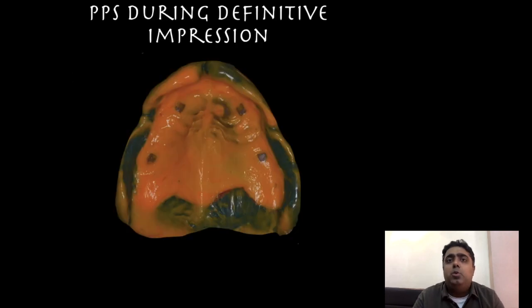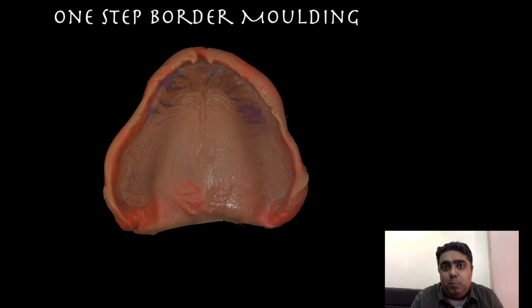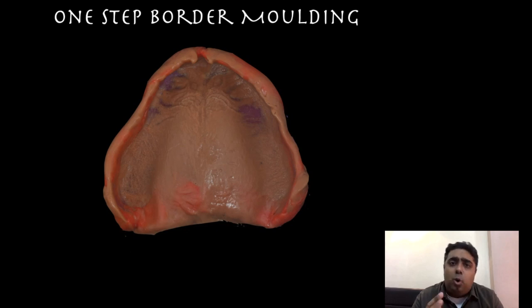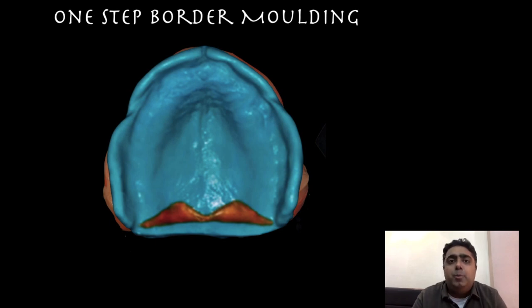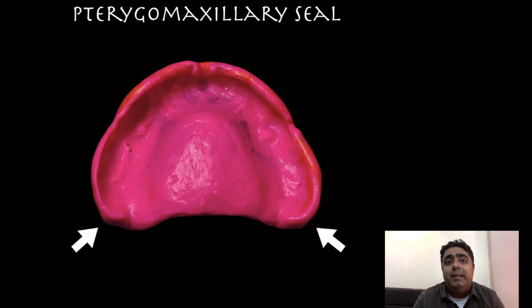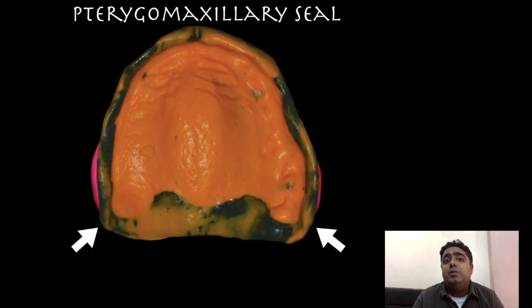Another final impression made through the similar technique is shown here. Another variant in recording the PPS during the final impression stage is making use of a soft putty or heavy body in a single-step molding protocol. An inherent disadvantage here is less retention due to the nature of the material when compared with compound. Scraping the posterior region or, after an adhesive application, layering it with fluid wax might be a good alternative, but it is a time-consuming procedure requiring elaborate armament. The pterygomaxillary seal can be appreciated well in this impression as it gradually merges anterolaterally to the mucogingival junctions ahead. Sometimes it may not be symmetrical, owing to the size of tuberosities on either side.